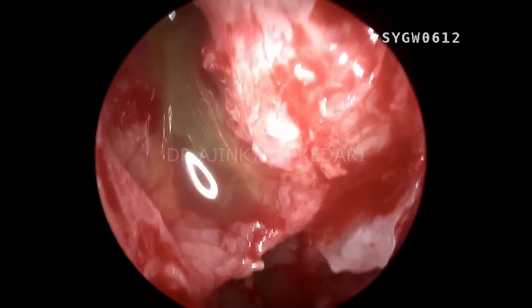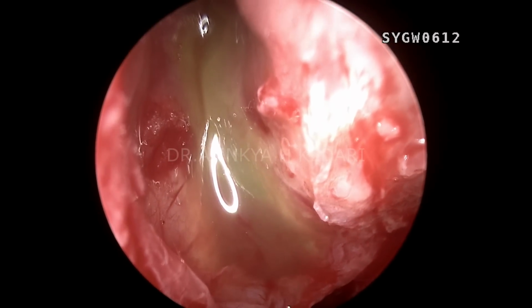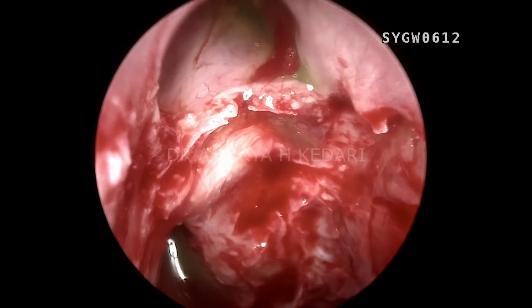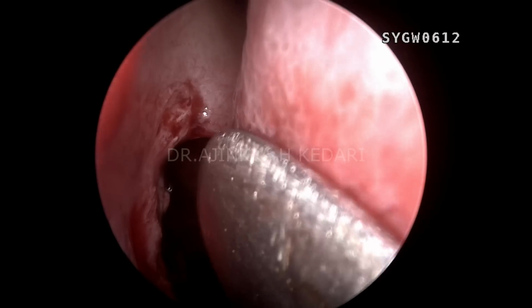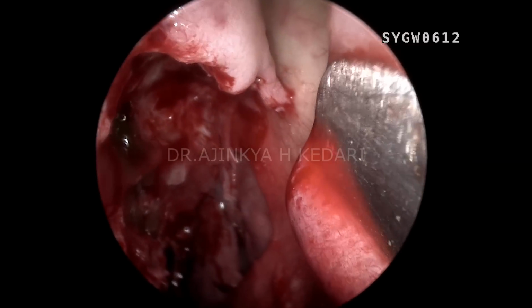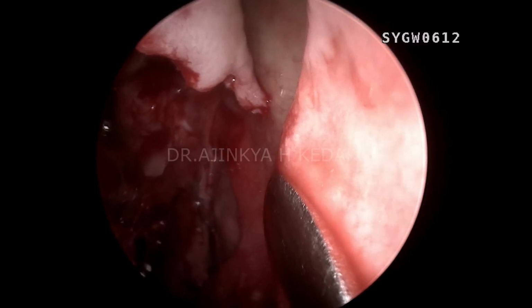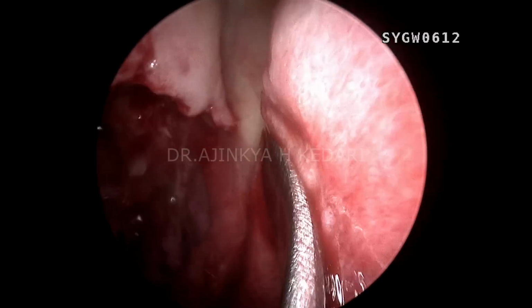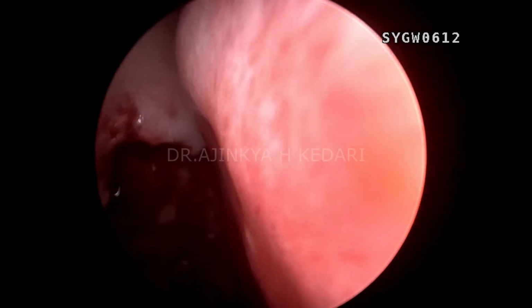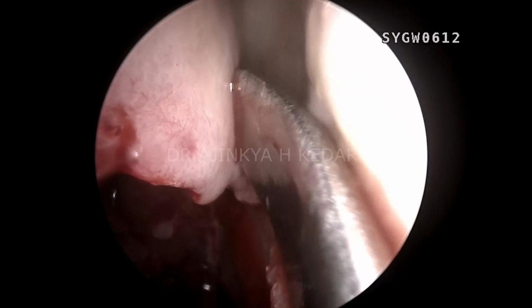So you can see that's the posterior ethmoids basically. One leak is in the posterior wall of the frontal sinus towards the lateral aspect, which we cannot see right now, for which I'll have to do a Draf procedure, which I'll be doing right now. I'll show how to do a Draf procedure on one side, an extended Draf on the right basically. It's not the usual Draf, it's an extended Draf on the patient's right side.